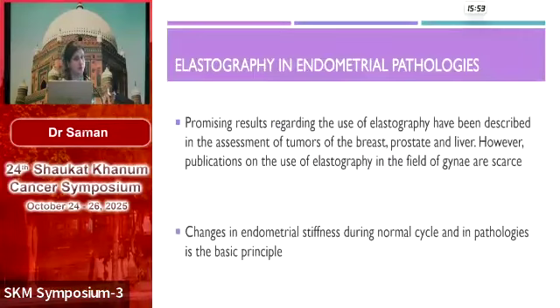Now, in case of endometrial pathologies, what is the role of elastography? We know that there have been enough data and a lot of publications on the use of elastography in the assessment of tumors of the breast, prostate, and liver. However, the literature on the use of this technique in gynecological cancers is not very much. There are very few studies done on this particular case.